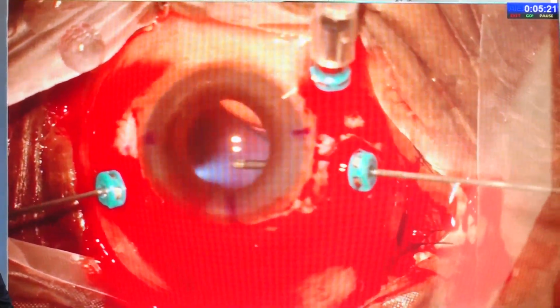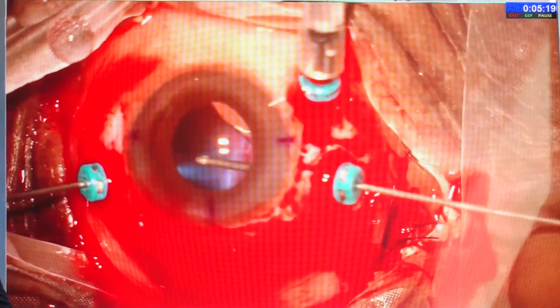It's a toric monofocal IOL. And whenever we see such a picture, there is always a temptation that we'll go ahead and bring it out into the anterior chamber without doing a complete vitrectomy. But as you can see, we need to do a vitrectomy around the haptics. The haptics are nicely entangled in the vitreous.